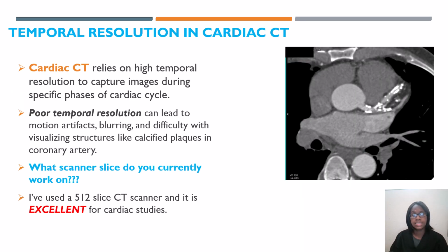And cardiac CT relies on high temporal resolution to capture images during these specific phases of the cardiac cycle. If you have poor temporal resolution, this can lead to motion artifacts, blurring, and difficulty with visualizing structures like calcified plaques in the coronary artery.